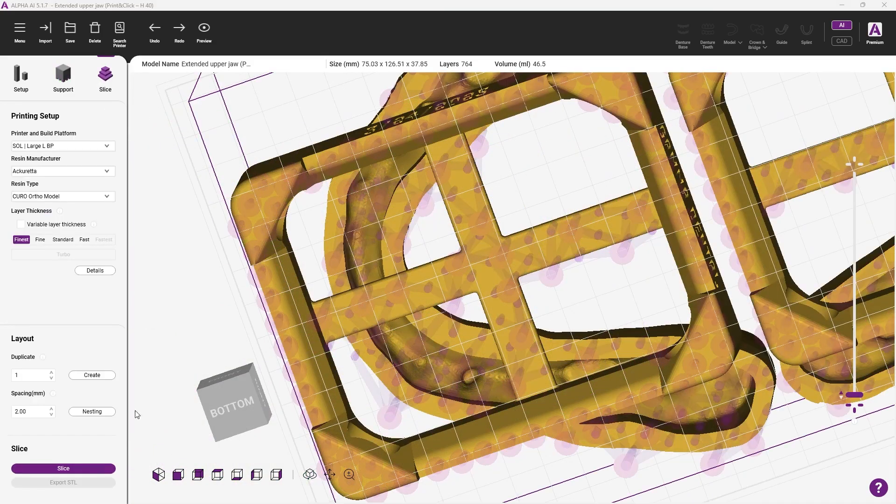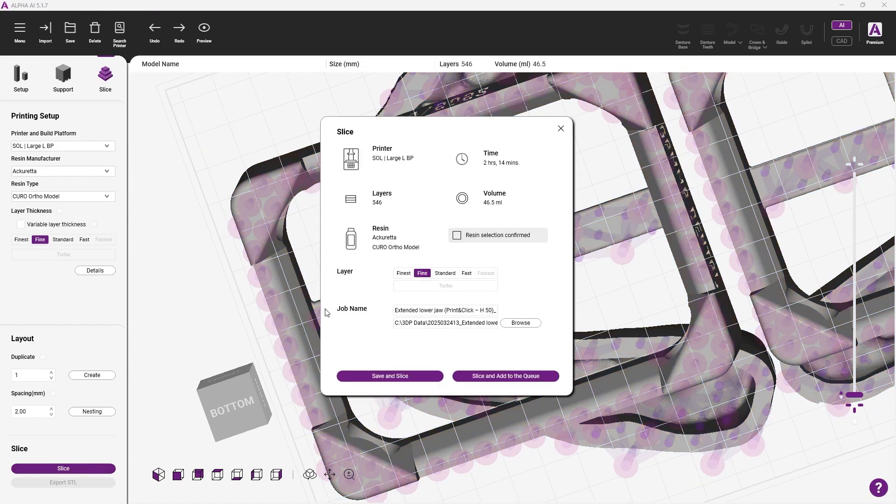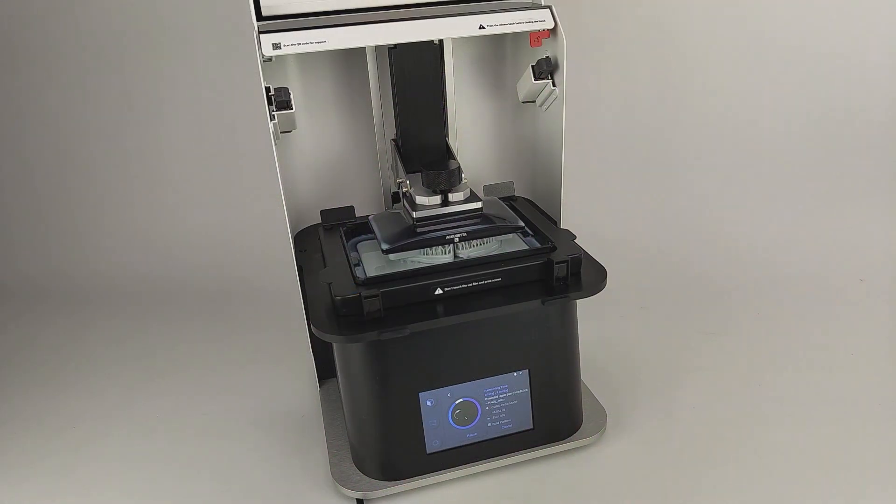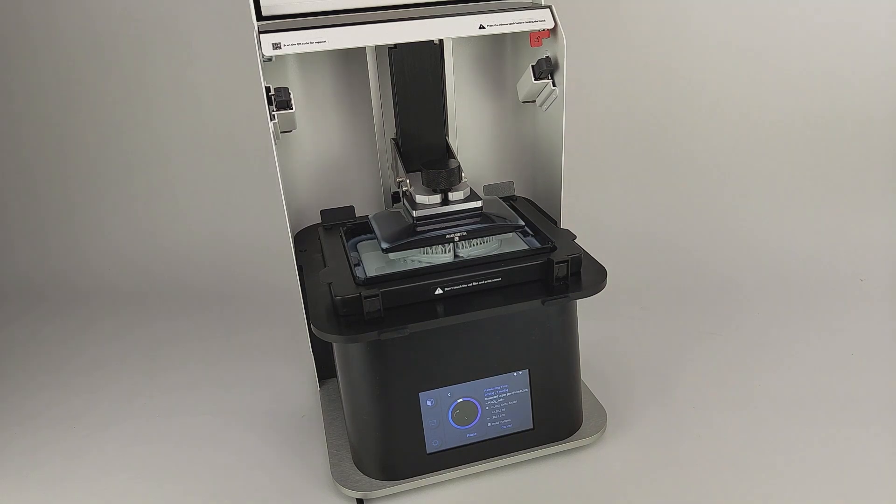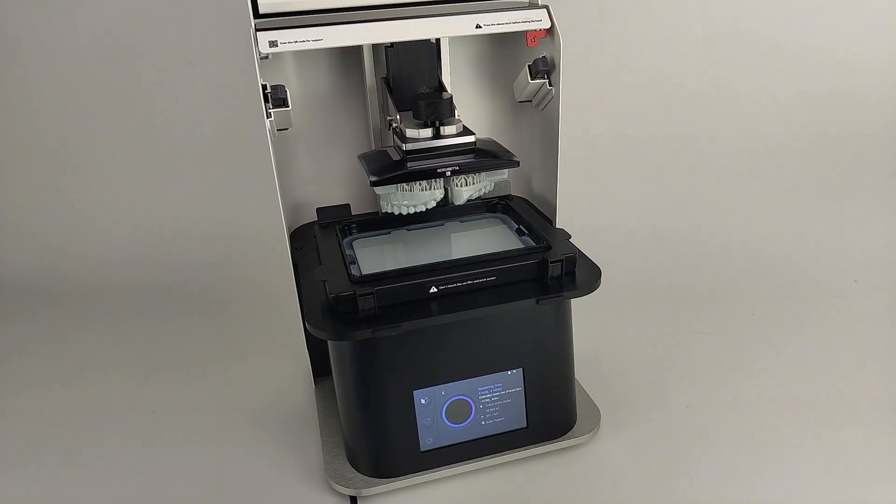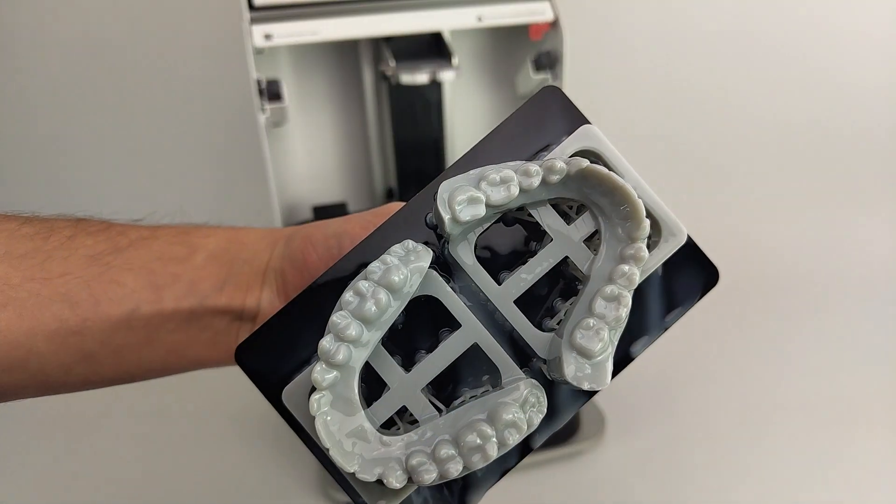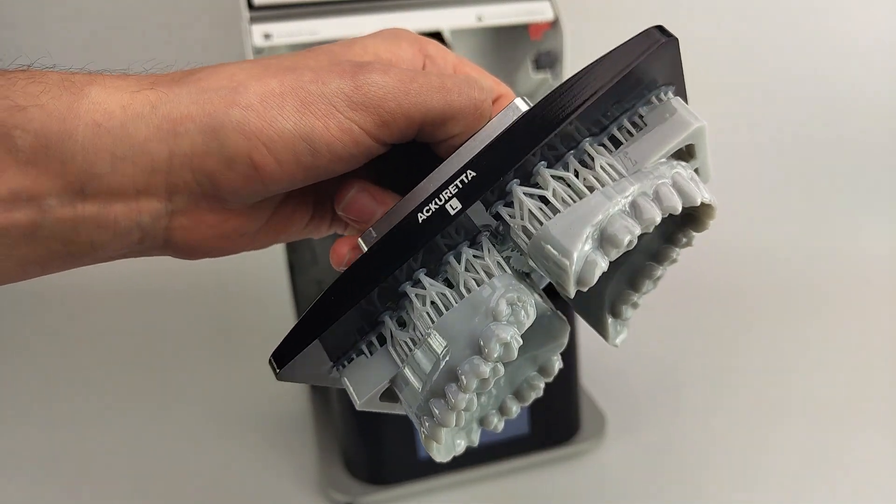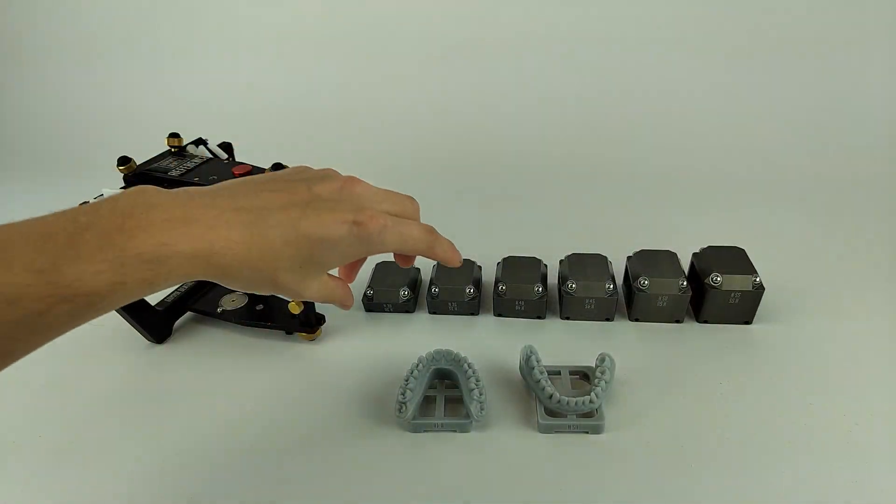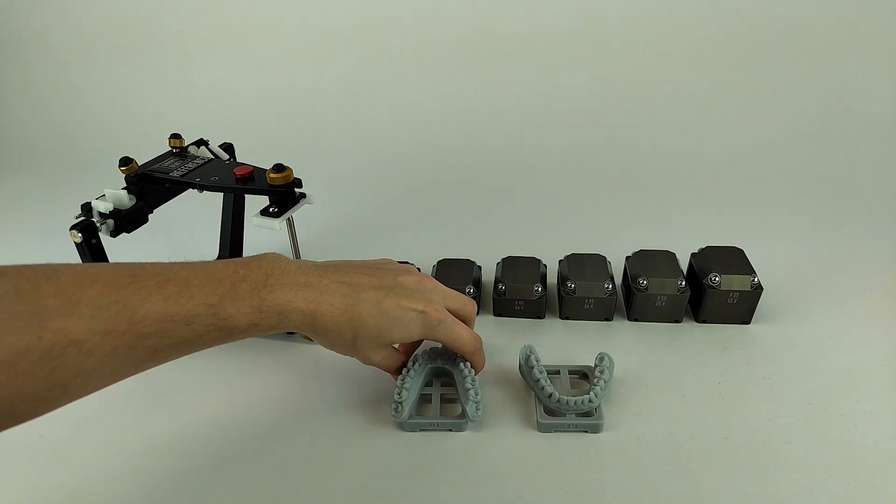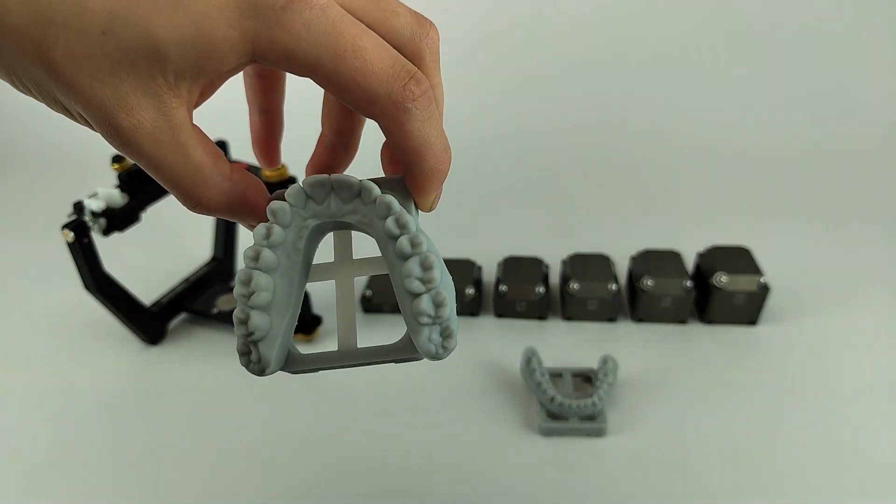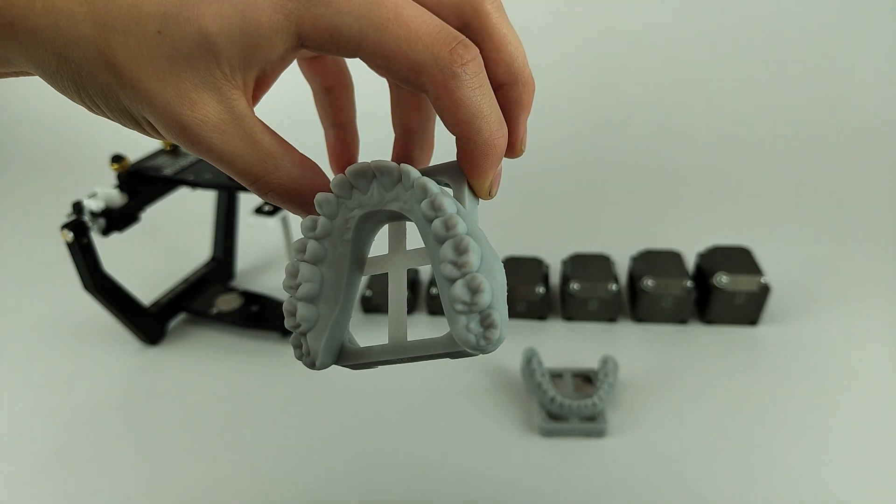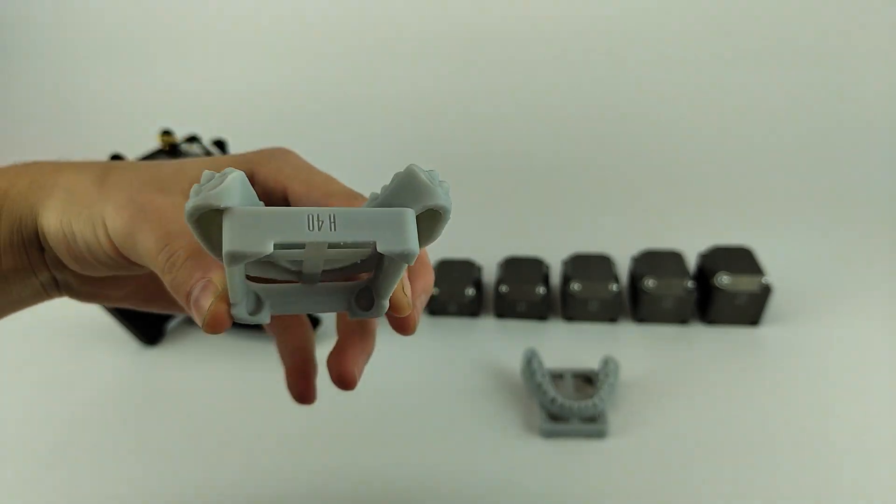Slice the models and start the printing process. The models are now finished and ready to be clicked into the blocks. Therefore, select the block with the height written on the baseplate of the model and click it in.